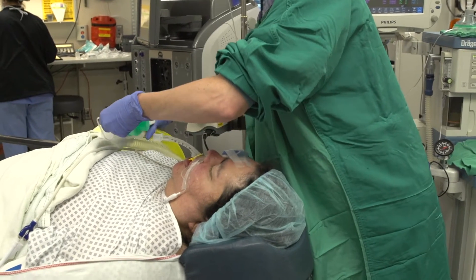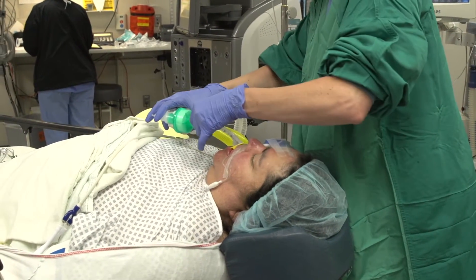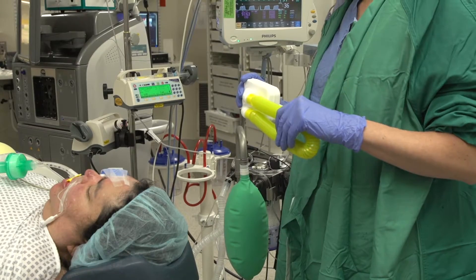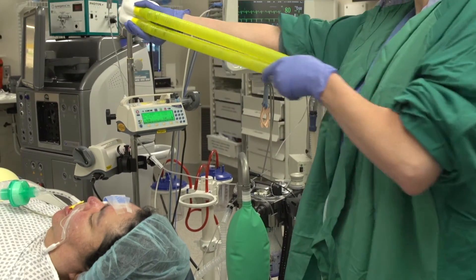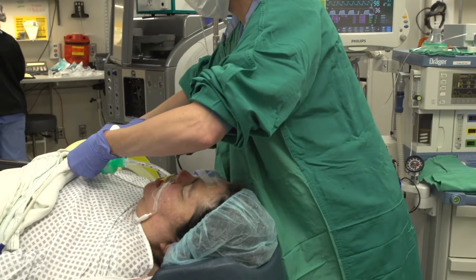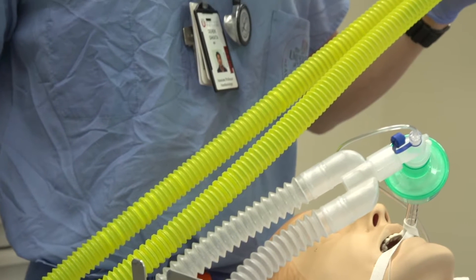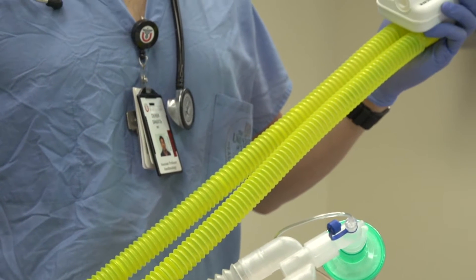Additionally, AniClear can be inserted into the breathing circuit just preceding the start of emergence. It is recommended to fully extend the re-breathing loop before placing AniClear into the breathing circuit to minimize the risk of inadvertently dislodging the endotracheal tube or laryngeal mask airway. Full extension of the re-breathing loop provides 750 milliliters of dead space to allow for maximum re-breathing of carbon dioxide and optimization of AniClear benefits.